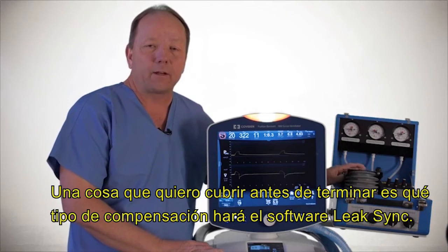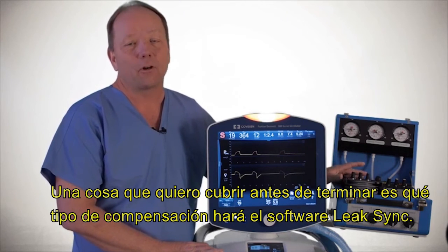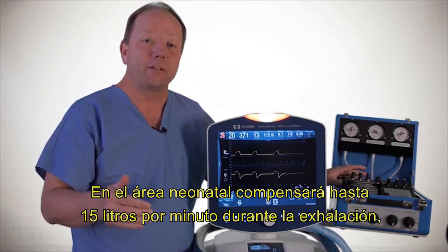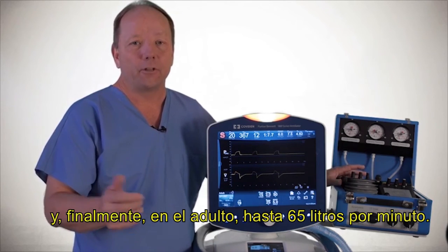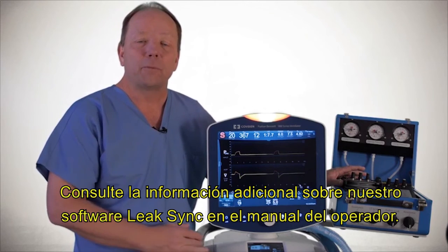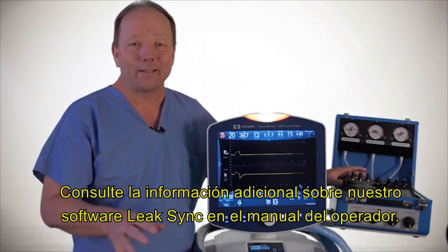Now, one of the things that I want to cover before we finish is really what kind of compensation the leak sync software will do. In the neonatal world, it will compensate up to 15 liters per minute during exhalation. On the pediatric, it will do 40 liters per minute. And finally, on the adult, it will do 65 liters per minute. So with that, please make sure that you look at the operator's manual for any additional information around our leak sync software.